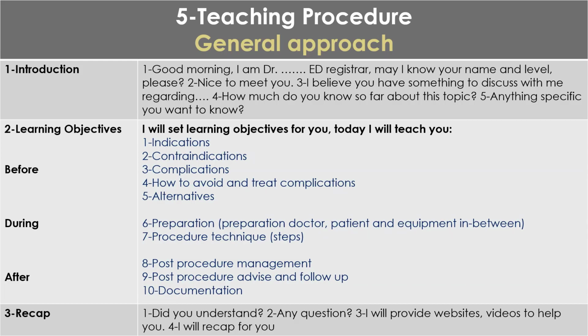So talking about indications for catheter passage, first of all, if you've got a patient in urinary retention, you want to put a catheter to relieve that retention. The other thing is for very sick patients that you're giving IV fluids, it's important to have a catheter in them to help monitor the urine output very accurately.